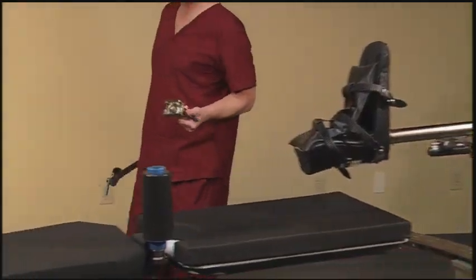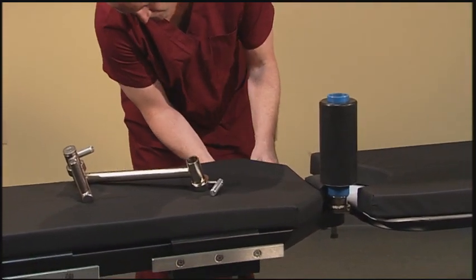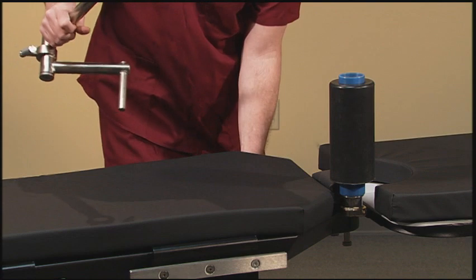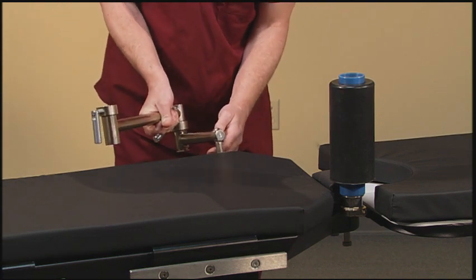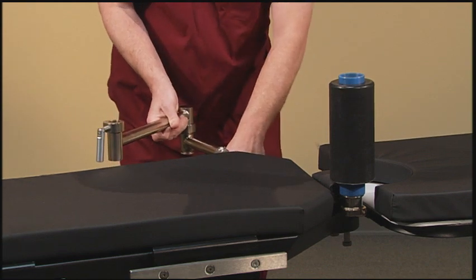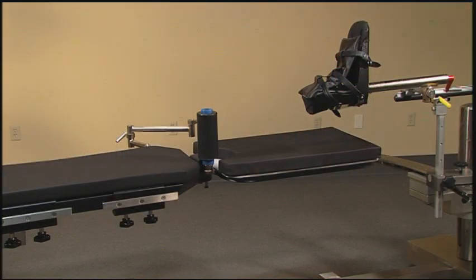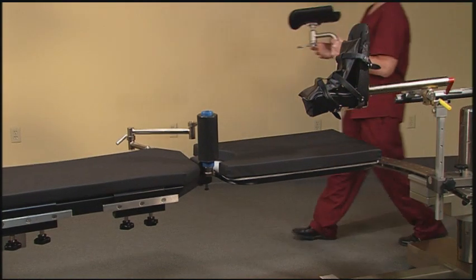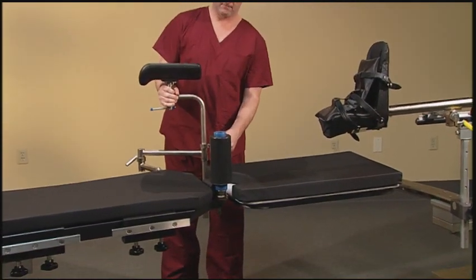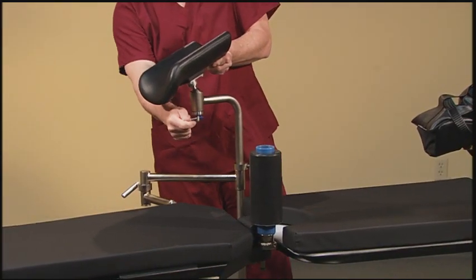The next step in the setup procedure is to attach the well leg support using a side rail socket and an articulating bracket. That will be attached to one of the removable side rails on the non-operative side. The articulating bracket allows the leg to be moved to the desired position at the surgeon's request. The well leg support is mounted onto a ball socket for patient comfort during the procedure.